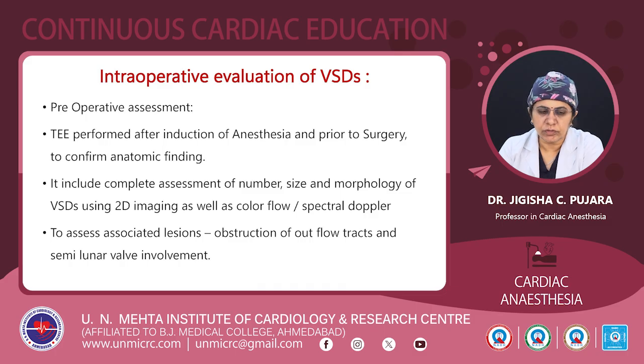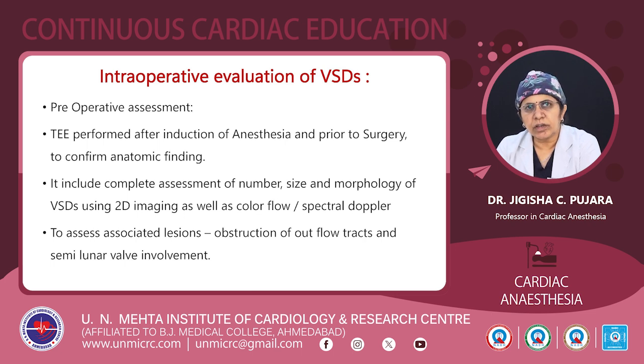Intraoperative evaluation of the VSD, pre-operative assessment. TEE is performed after the induction of anesthesia and prior to the surgery to confirm the anatomical findings on 2D echocardiography. It includes the complete assessment of the number, size, and morphology of the VSD using 2D imaging, as well as color flow and spectral Doppler to assess associated lesions, obstruction of the outflow tract, semilunar valve involvement, or any other pathology.